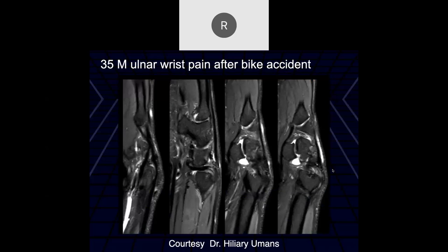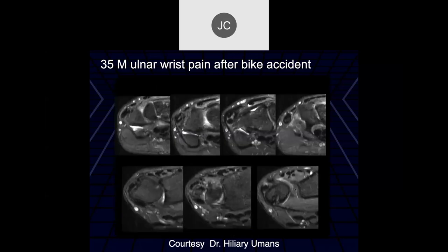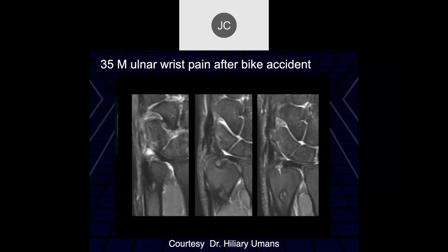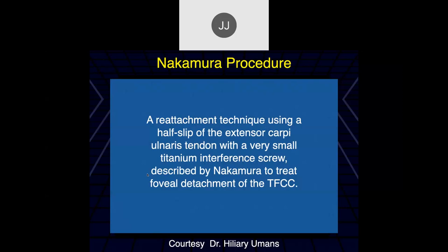35-year-old with ulnar wrist pain after a bike accident. I'm not quite sure what's coming across the distal ulna — is this post-surgical? Maybe the tendon's going through a tunnel, the ECU going through a tunnel? Yes, this is post-surgical — this is called a Nakamura procedure, a graft procedure to try to stabilize the distal radial ulnar joint in lieu of a TFCC.